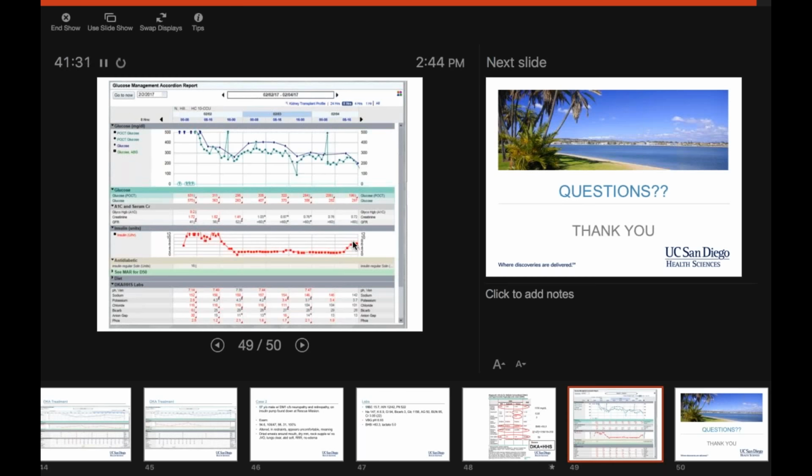That's huge. Or we really talk with help nurses to remind him or her. Really, because that button is new. You guys weren't getting the phone calls anyways a lot of the times. So we want to make sure that is being done appropriately. So whenever the opportunity arises, always communicate with the nurse. Hey, we're going to be turning down the dextrose. Push the button when you change the rate. When you say the button, just make it clear for everybody. The nutrition on hold, yes, button or decrease.